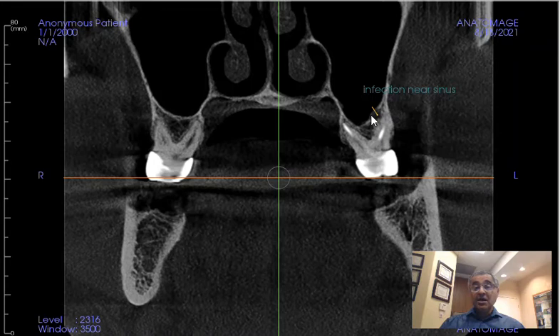And basically what that meant was the patient had to wait till there was enough damage in the bone so we could see it, or the pain had become severe enough that they knew exactly where it was coming from. With this system, it just makes it much easier to diagnose.